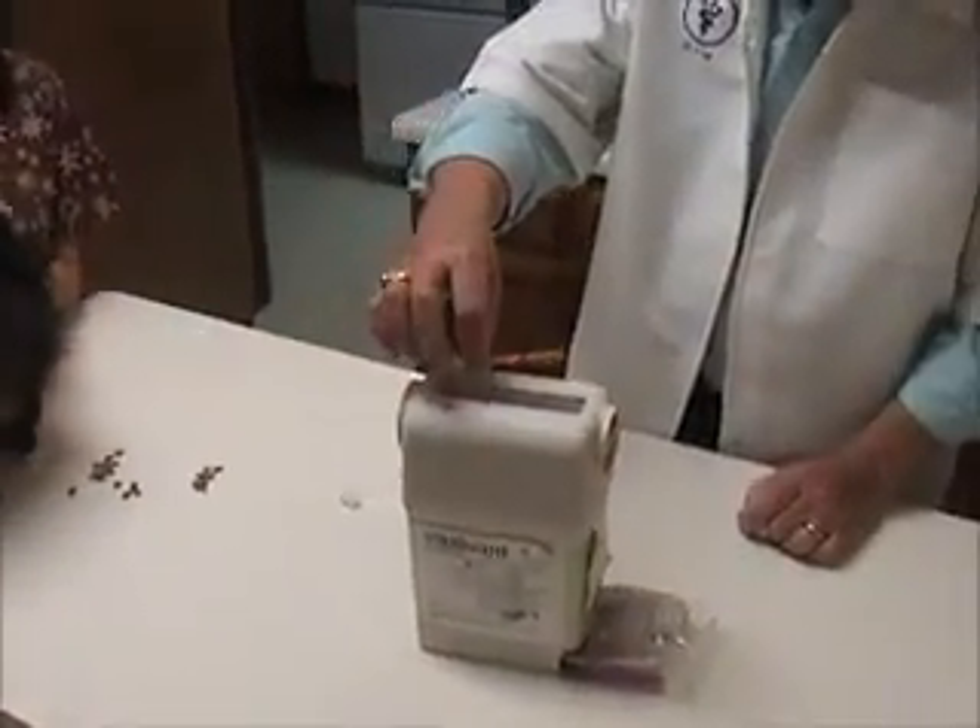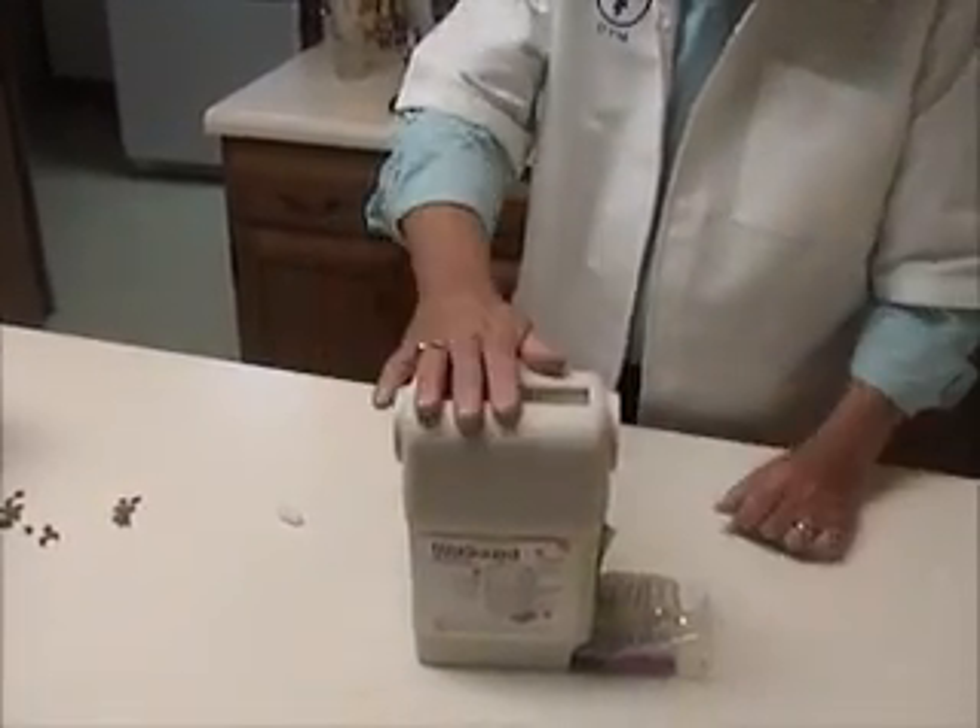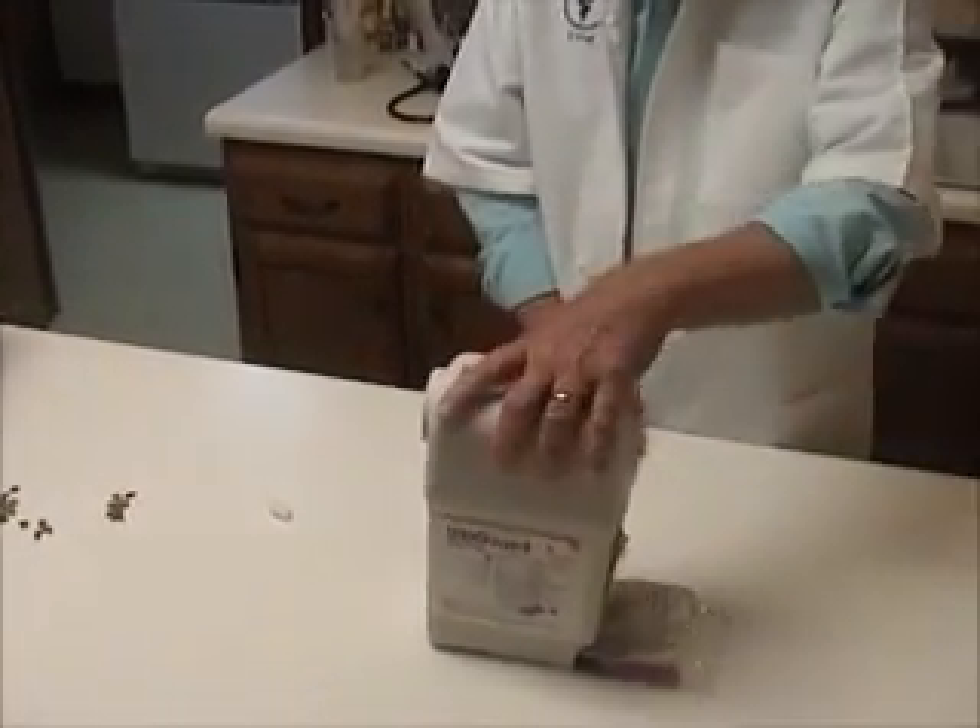And to get rid of the empty syringe, you simply place it in here, turn it, it goes into a trash barrel there. When the thing is full, you just simply throw it in the trash.